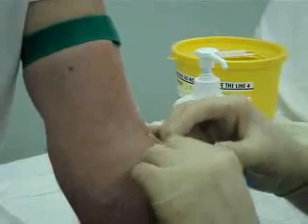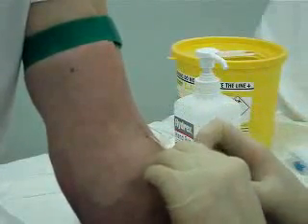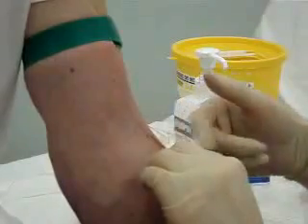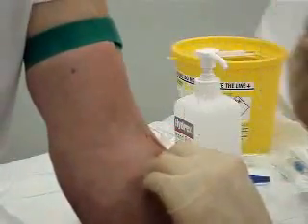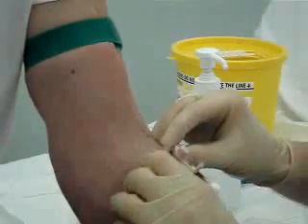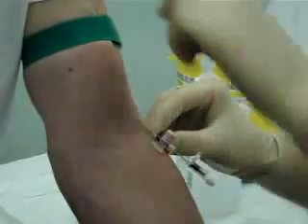Okay. At this point, both the needle and the plastic tube are in the arm and in the vein. But what I'm going to do now, just keeping the rest of the cannula stable, is just withdraw the needle. You can see as I do that, the blood flashing back into the cannula. What this means now is that the plastic cannula is now over the top of the needle, and I can then advance that plastic cannula up into the arm. Okay, and as you're doing so, you can slowly draw back on the needle.